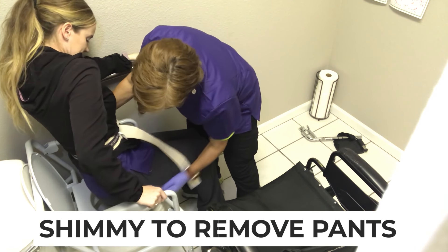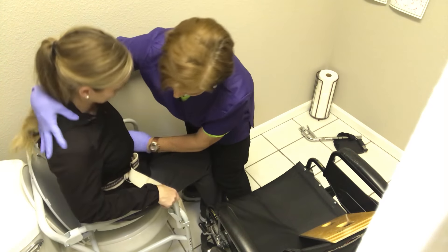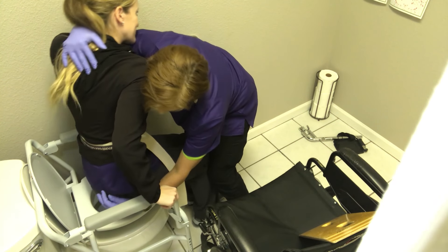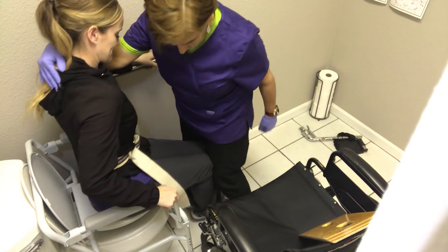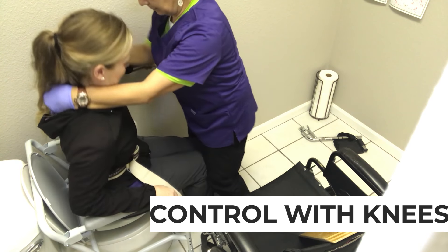I can shimmy and go apart this way and then back this way. If they don't have good trunk control, I may lean them forward, but I'm controlling them with my knees. That's how I work on getting that off.